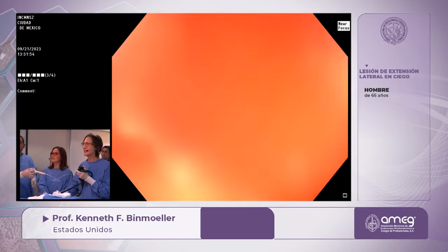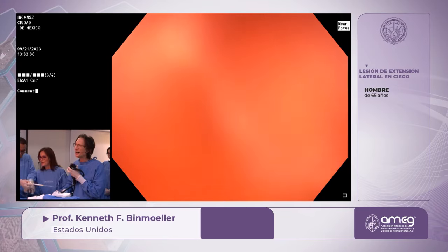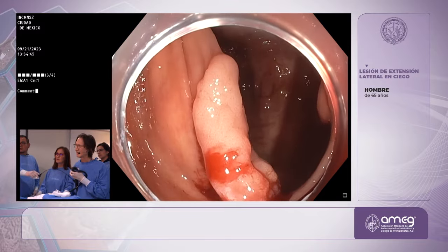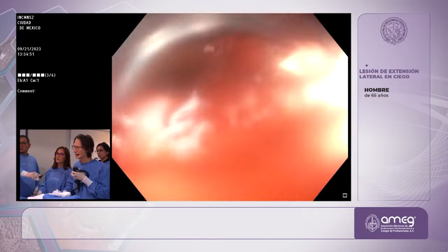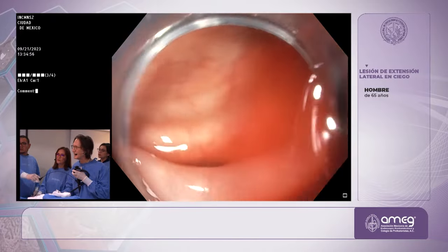All right, so we do have some bleeding because you see the blood now. So we're going to have to switch on the gas because underwater, I can't see. It gets cloudy. Oh, it looks like there's still lesion left, huh? So I only got part of it. Yeah, I did not get the whole lesion, which is strange. It looked like I got the whole lesion. No, yeah, that's the tick.